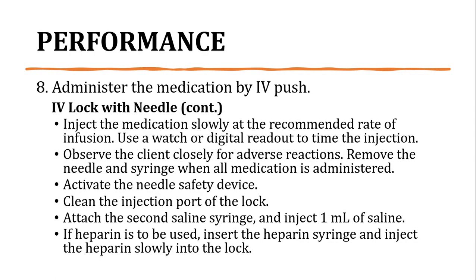Then, inject the medication slowly at the recommended rate of infusion. Use a watch or a digital readout to time the injection. Kailangan po i-administer slowly ang medication using IV push because it is directly administered to the client, to the vascular system of the client. Kailangan po slowly para maiwasan yung adverse effects kasi kapag rapid yung pag-administer ng medication using IV push, baka magkaroon ng adverse reactions such as shock or something like that.